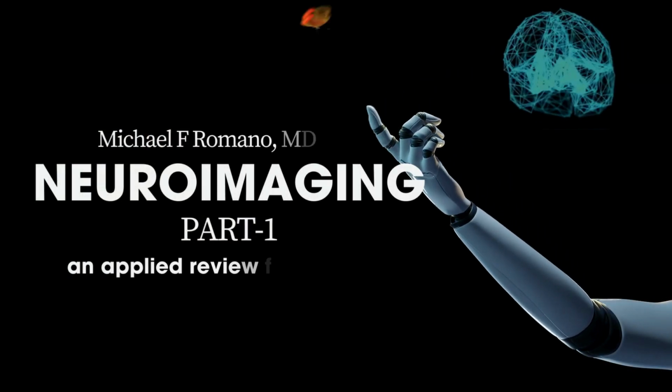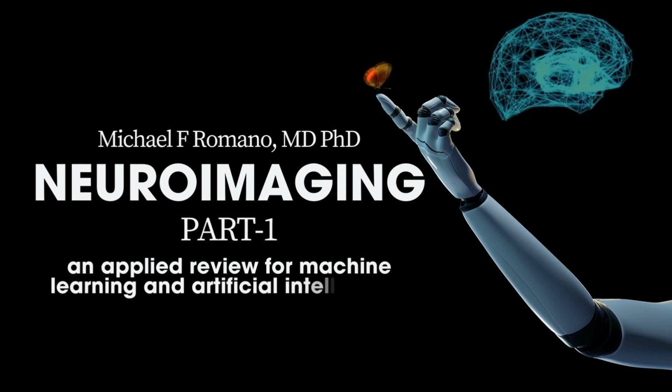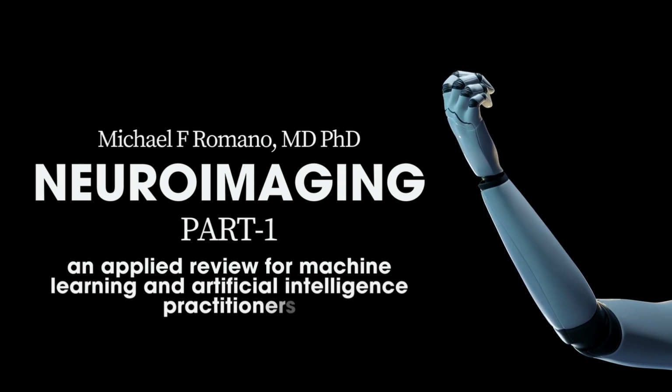Hi everyone, my name is Mike Romano and welcome to our Neuroimaging series. This is part one of the series where we will cover the basics of brain MRI sequences.